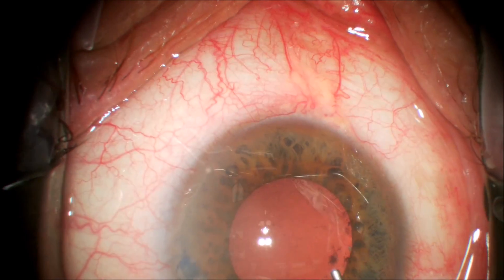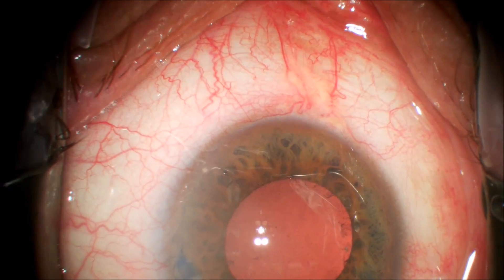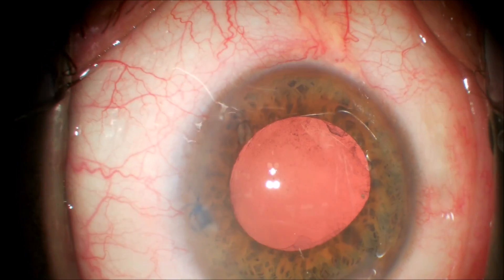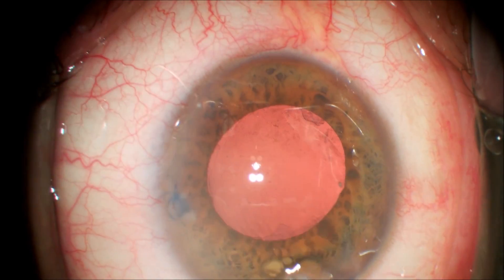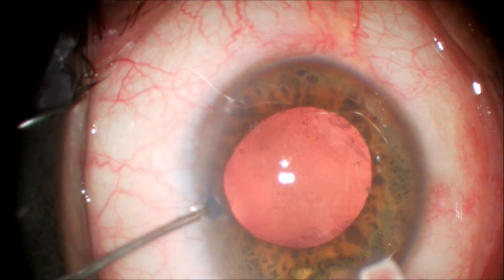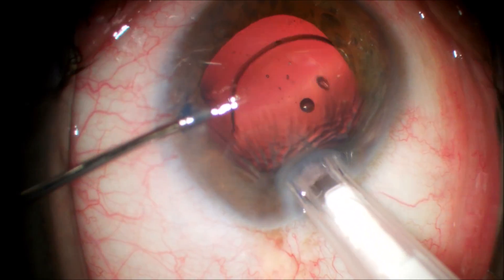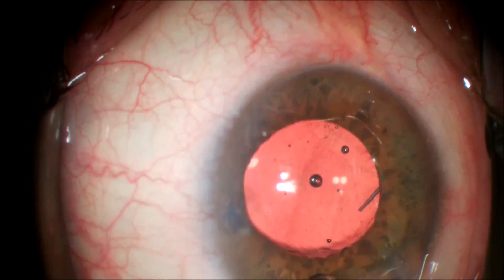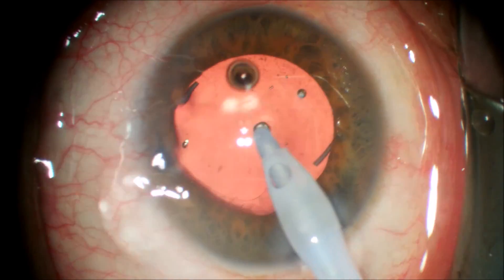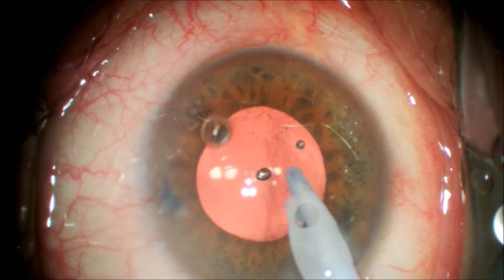We're going to fill the capsular bag with a cohesive viscoelastic. As this is an intact can opener capsulotomy, we're going to inject a three-piece silicone lens into the capsular bag. We placed three-piece lenses in the capsular bag often when we did extracapsular cataract extraction — I don't think a can opener capsulotomy is a contraindication to this. We inject the silicone three-piece LI-61AO into the capsular bag and it easily centers. We then remove the residual viscoelastic — in this case it is Healon — and any cortical material that remains in the anterior chamber.